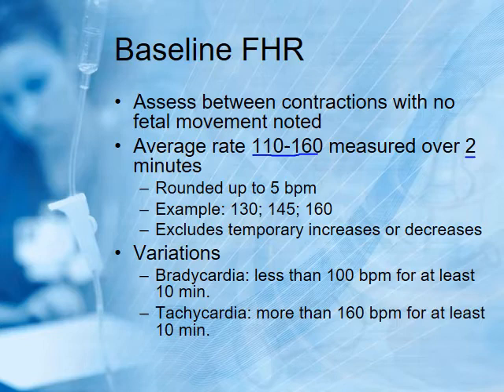Variations: bradycardia is when the heartbeat baseline is less than 100 beats per minute for at least 10 minutes. And tachycardia, more than 160 beats a minute for at least 10 minutes. So those are brady and tachycardias.